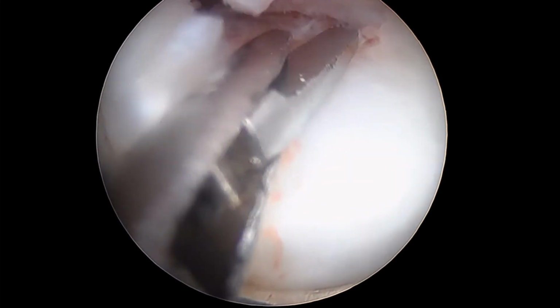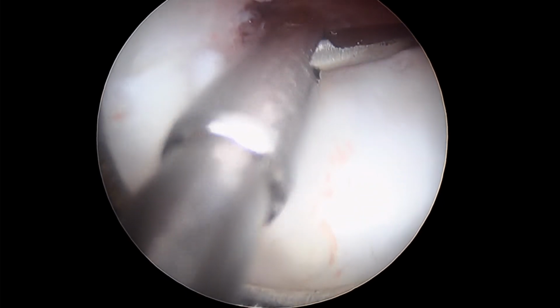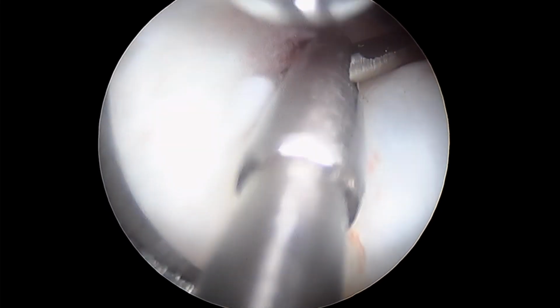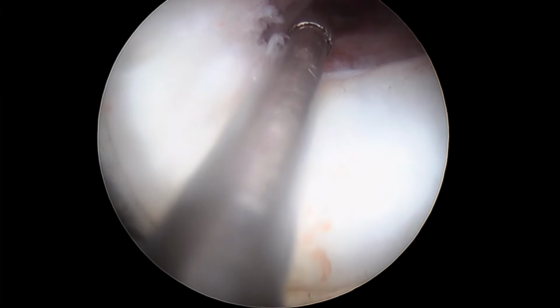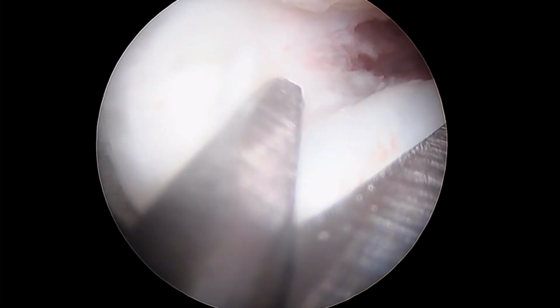Proper scissor manipulation is quite important in the management of synechia. Otherwise, if you do not technically use the scissor correctly, it is very common that you are going to end up with a perforation. And how do we know you've perforated?